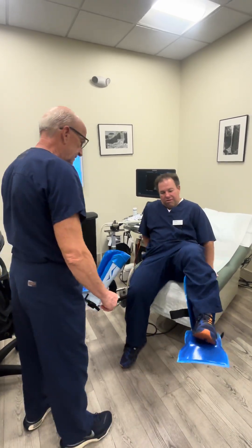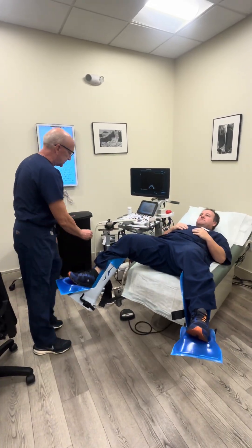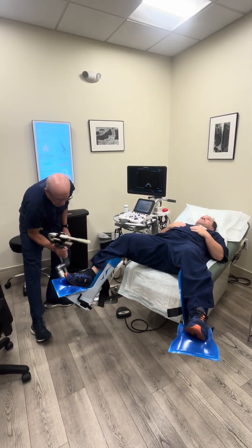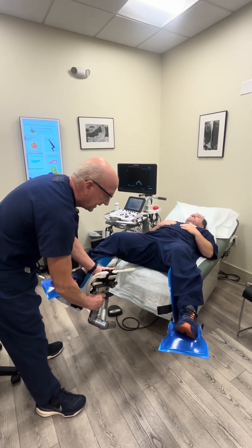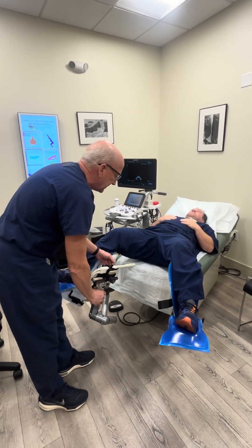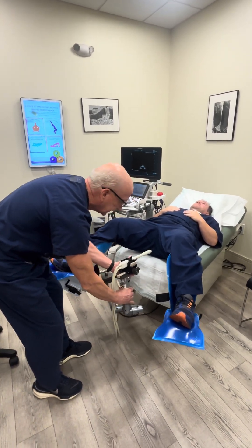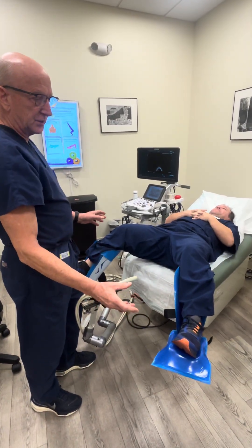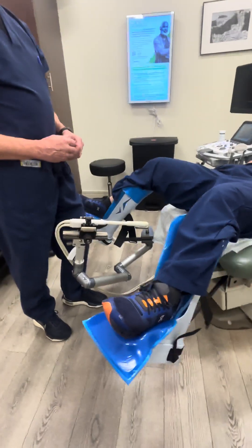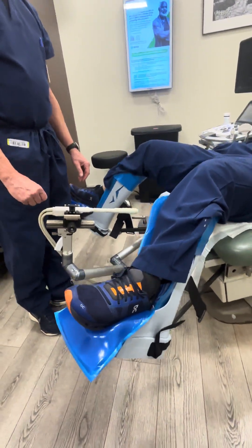The positioning is all the same for all of our procedures — the REZUM, the SpaceOAR, the transperineal biopsies. Easy placement. The patient's close to the end of the table, so we can get the probe into the rectum easily. The stirrups allow for us to have more comfortable patients in this lithotomy position, and we're able to clean these off easily when we're finished.